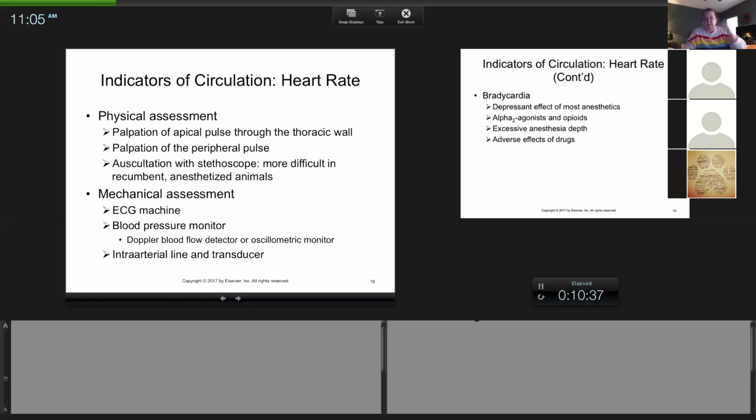So sometimes when people are scrubbing, the ECG goes off the screen because of movement, and then all of a sudden you get this really low heart rate. Well, it's because the ECG was not on the screen. It's counting what's there. And so all of a sudden you get this really low number. Then the ECG comes back and you get this really high number. It's looking at what's on the screen and it's estimating the heart rate. So the more movement and interference you have, the more irregularities there are going to be in the heart rate.